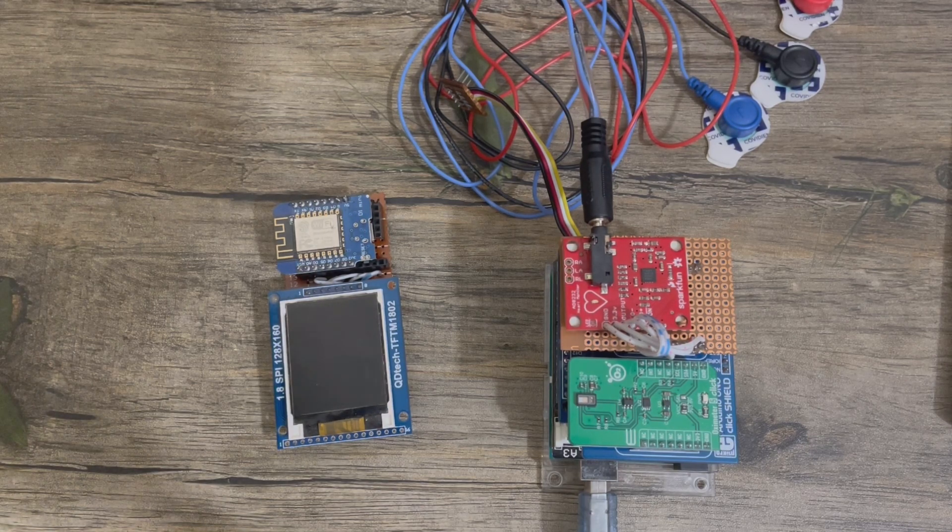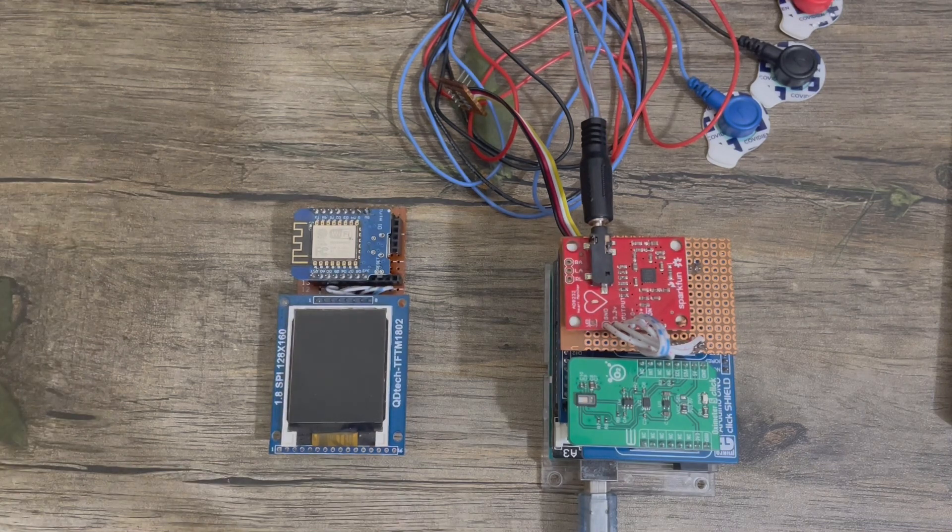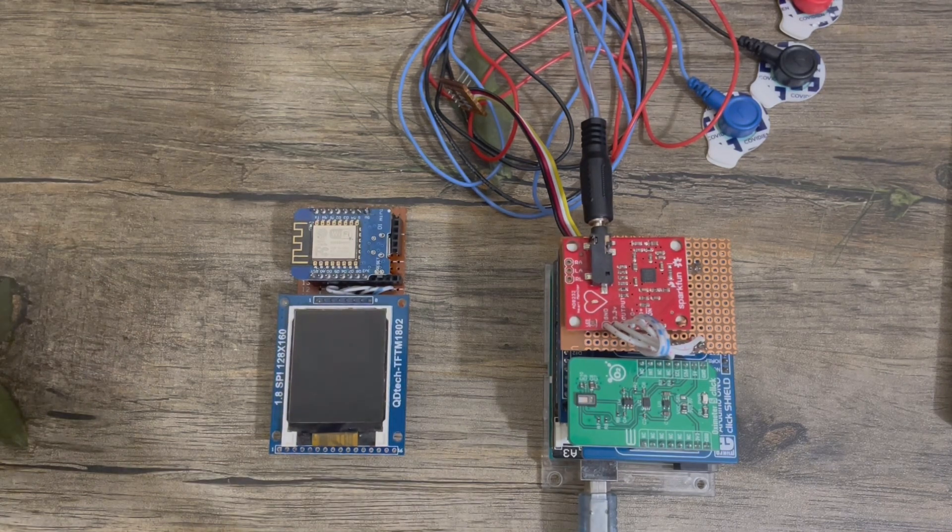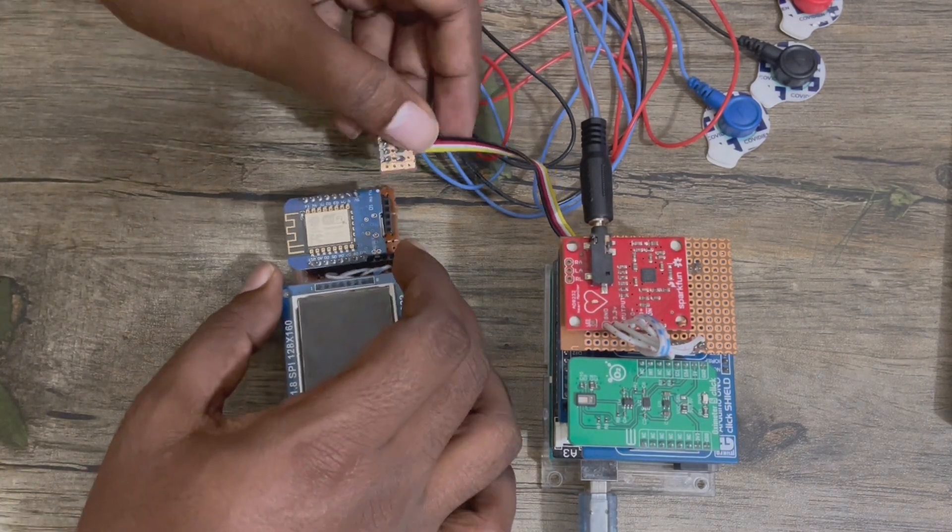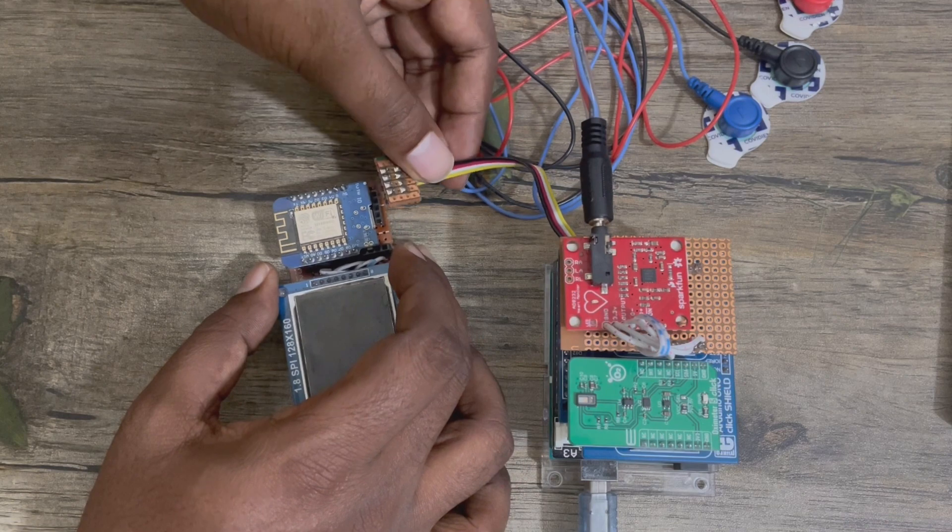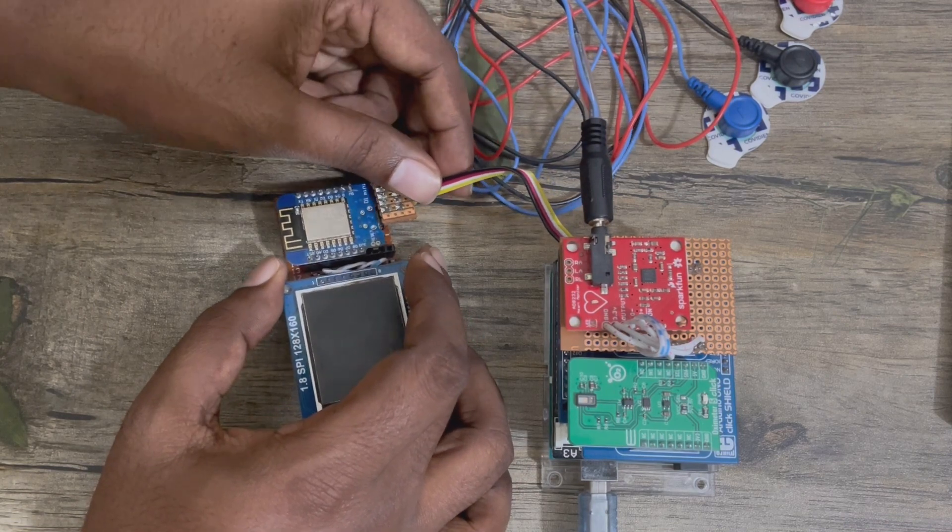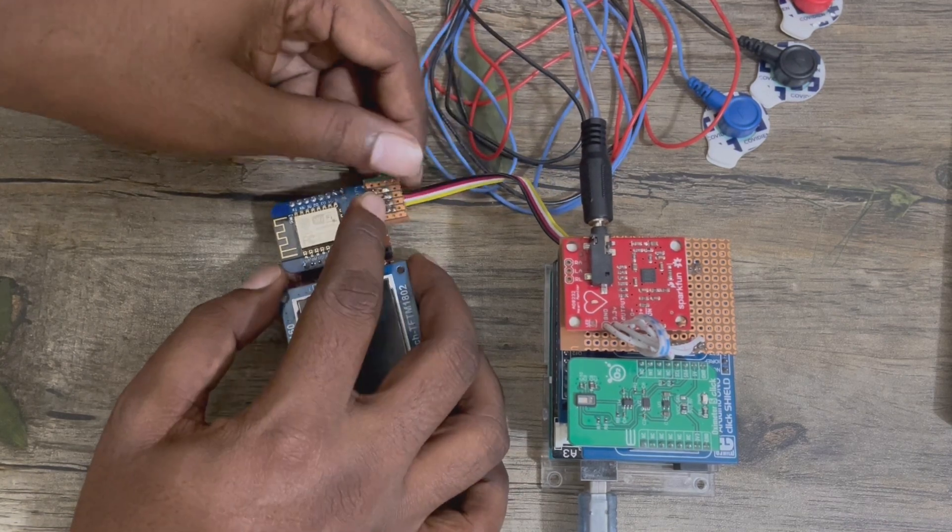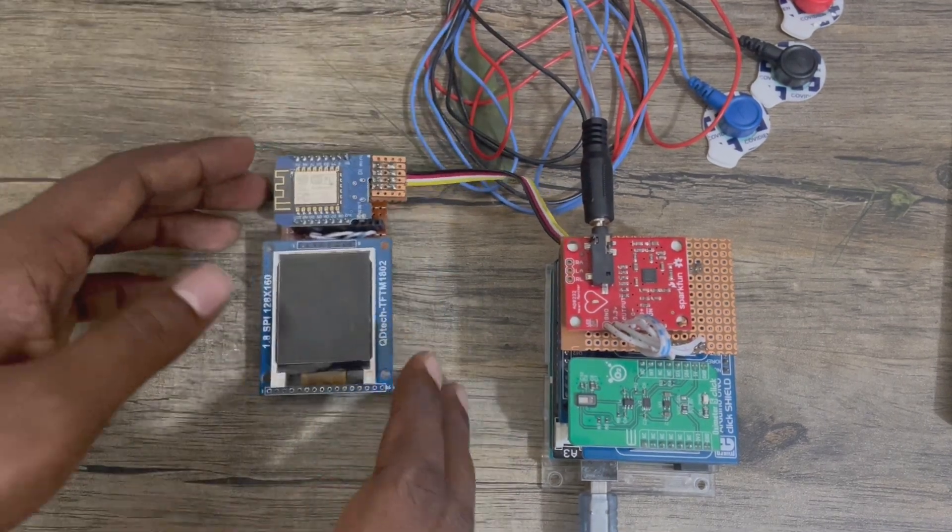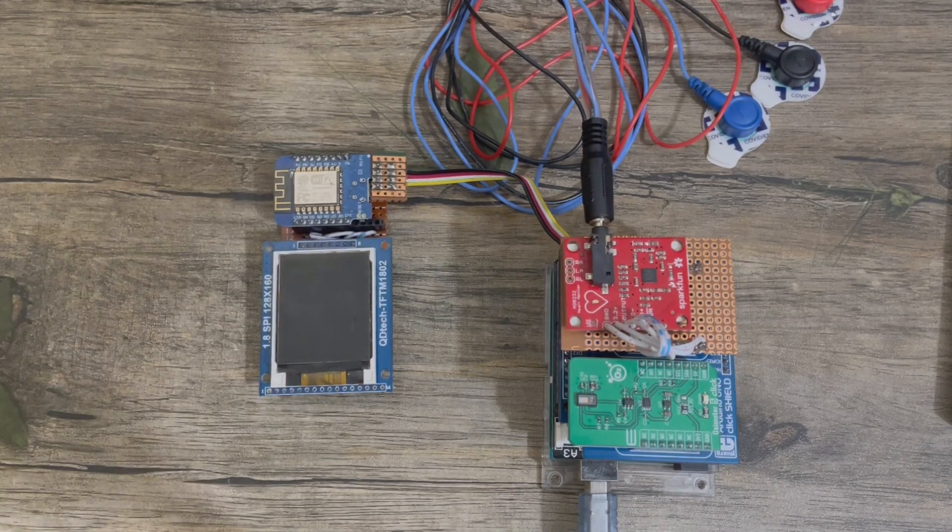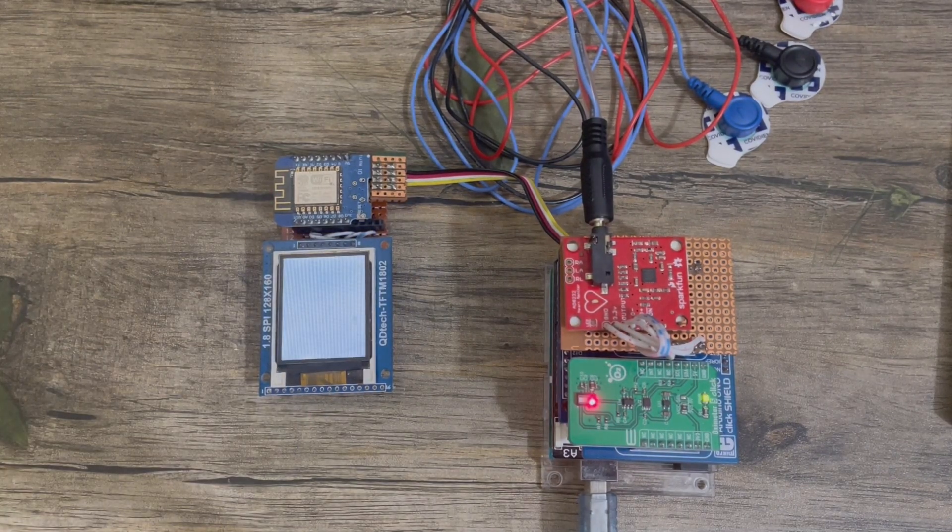Let's check the operation of the module. For this, let's connect it. Okay, this is connected. Power it up.